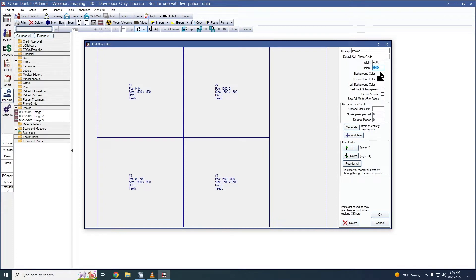I can also set the background color of the mount, as well as the default color for text and lines, and the text background color. I can also choose to make the background of the text transparent. I can flip on Acquire, which automatically mirrors the image upon acquisition. Use Adjust Mode After Series allows us to automatically enter Adjust Mode instead of Pan Mode after acquiring images into this mount. Adjust Mode allows adjusting an image slightly within its mount position or moving it to a completely different mount position. Pan Mode repositions the entire mount on the screen. Our measurement scale will be used when measuring lines on this mount, and we'll go into more detail on how to calibrate this scale in a few minutes. Clicking Generate will allow us to replace this mount definition with a completely new one.